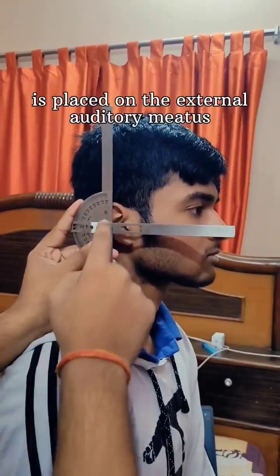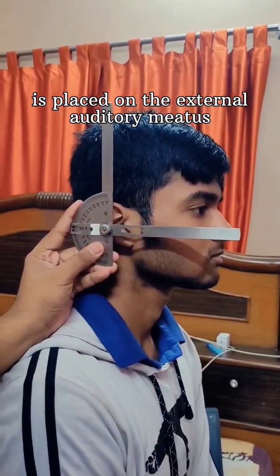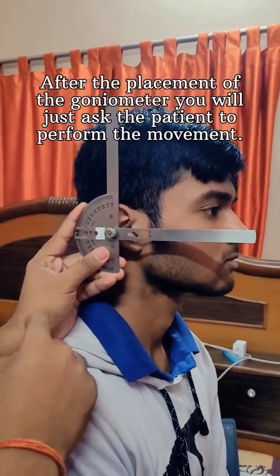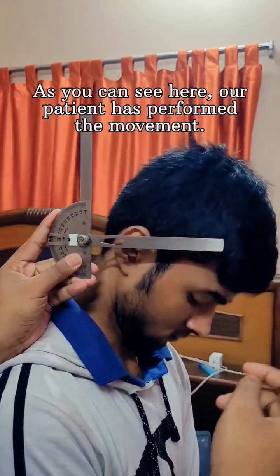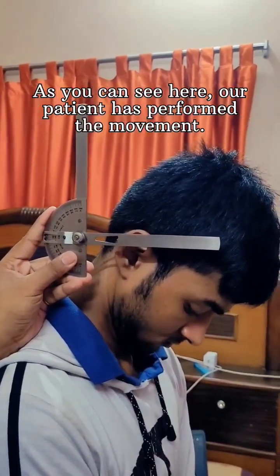The axis of the goniometer is placed on the external auditory meatus. After the placement of the goniometer, you will ask the patient to perform the movement. So perform the movement.